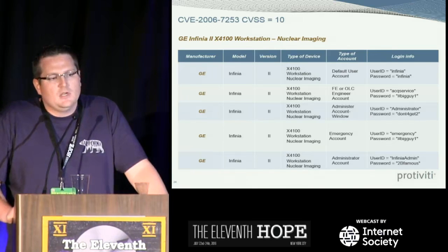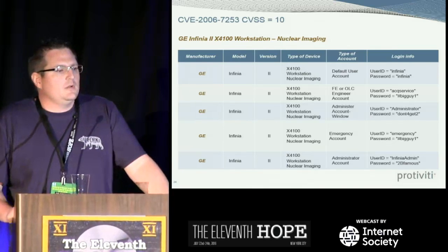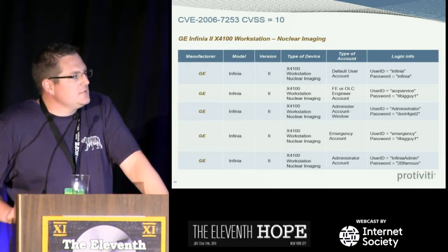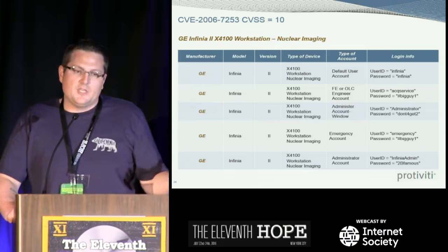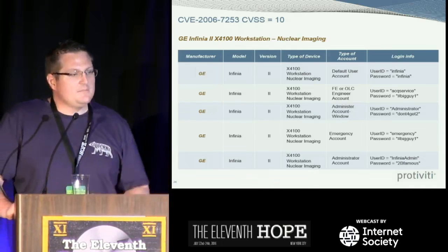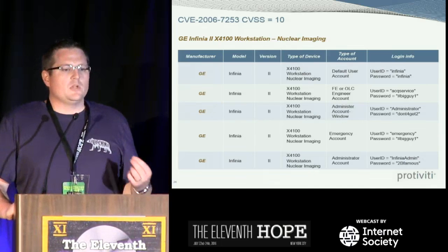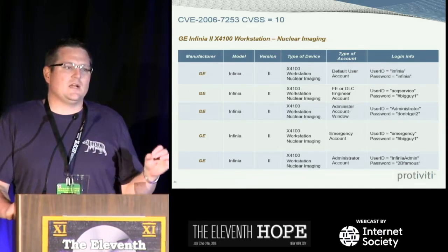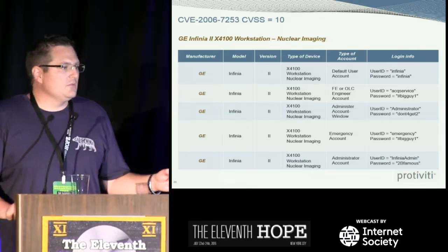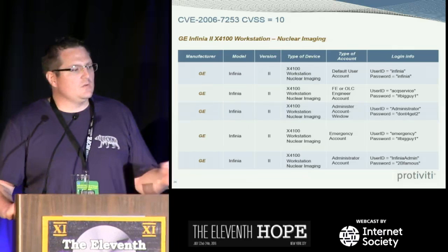So every CVE that we put out was given a CVSS score of 10 because they were remote admin access to the system. You'll also see the identifier of the year, and you're like, hey, Scott, have you been hoarding this since 2006? No. As I mentioned, since they were publicly available, we go back to the last instance of when that documentation was found on the internet, and then we reactively request the CVE back to that year. So that's why it was 2006.